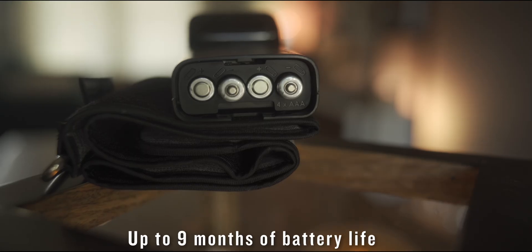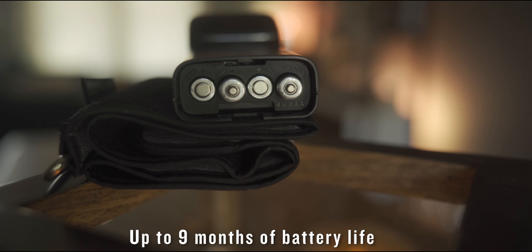It's worth mentioning that this monitor is eligible for purchase using flexible spending accounts or health savings accounts. When you purchase the Indexed BPM Monitor, you'll find in the box the Indexed BPM device itself, some documentation, and four AAA batteries that provide up to nine months of battery life.